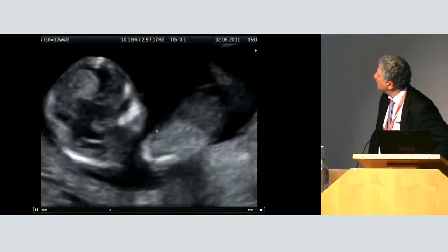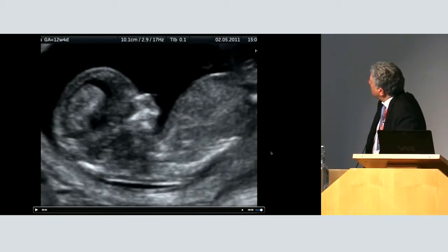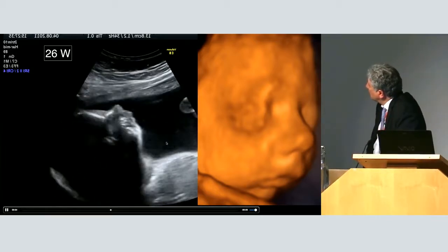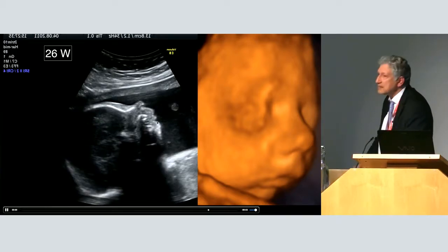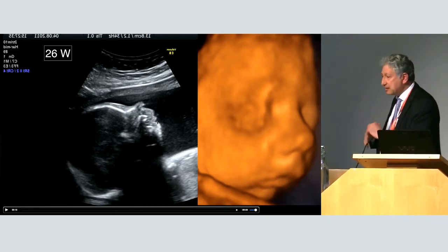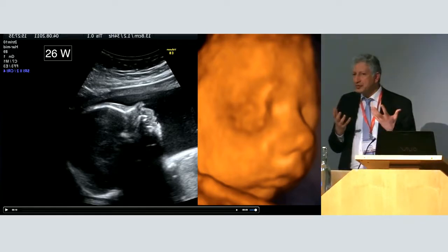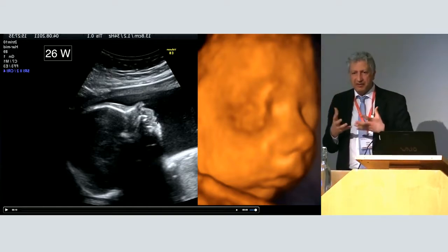So this is a video clip you see here at 12 weeks, transabdominal. And this is the same fetus later on, 26 weeks. Of course, you see the mouth downward, but it's less severe than we assumed in early gestation. So the lady came back this year and said the baby is fine. They had the operation of the palate, but she's very happy and so on. And when I saw the first picture in early gestation, I said, my God, it's going to be a very severe form. It's not true.